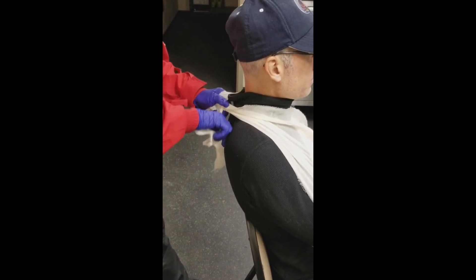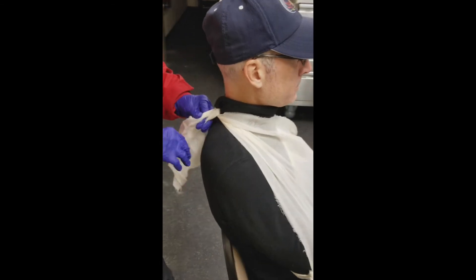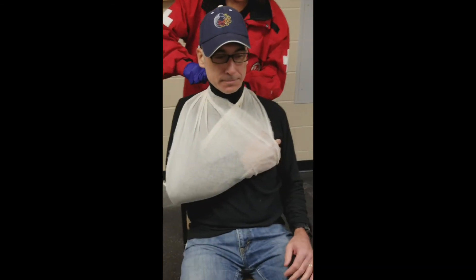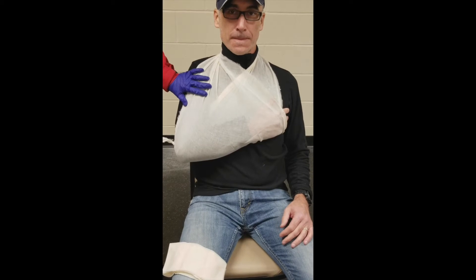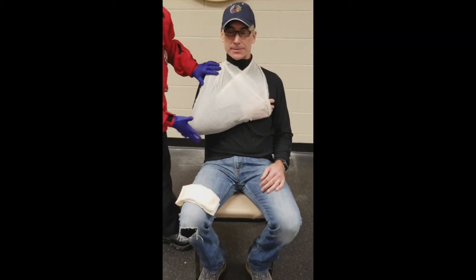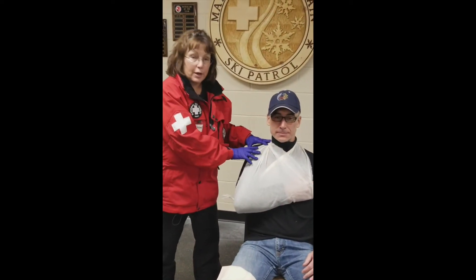We're going to tie it off. As with most things, there's more than one way to do that, but that is one of the easy, common ways. This supports the lower arm and takes the weight of the lower arm off of the shoulder area.